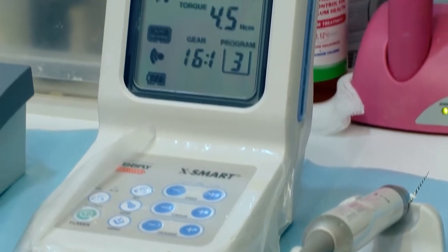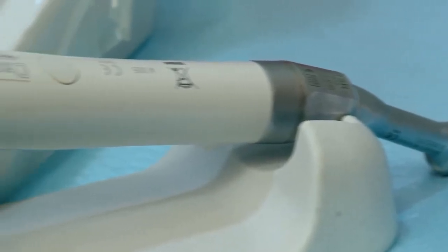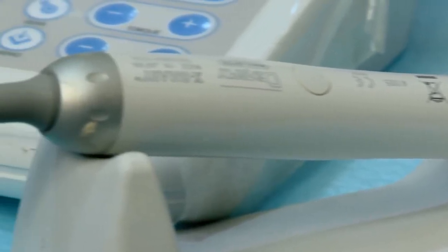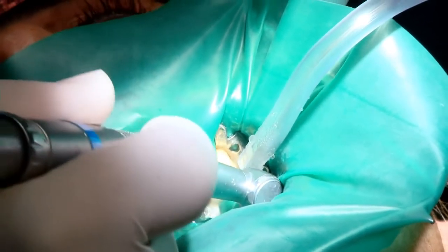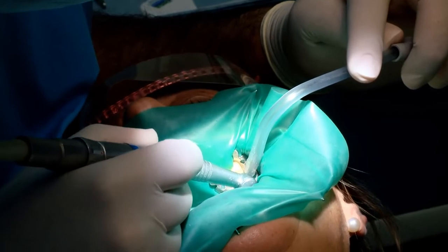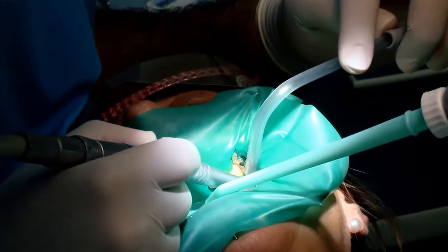The third tool would be the motorized technique. The motorized technique uses rotary instruments instead of hand-driven instruments. So instead of working with our fingers, which would take a few sessions in the past to make a normal root canal, now we can do that without taking a lot of time, because there are tools that do this in a rotary fashion. It's engine-driven. This makes the work faster and easier to do.